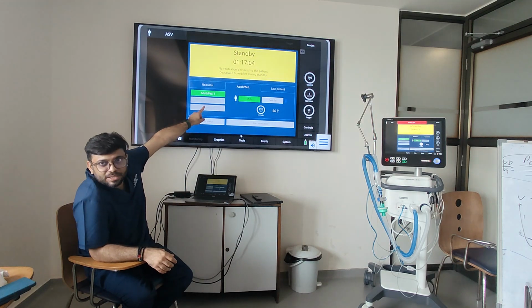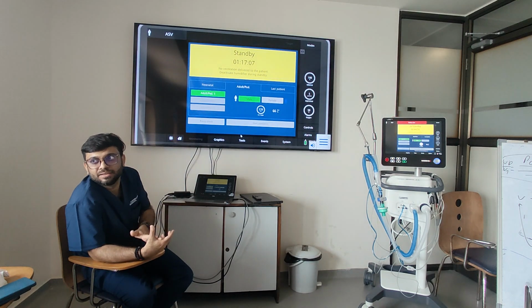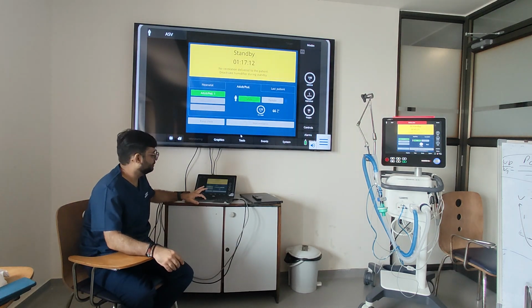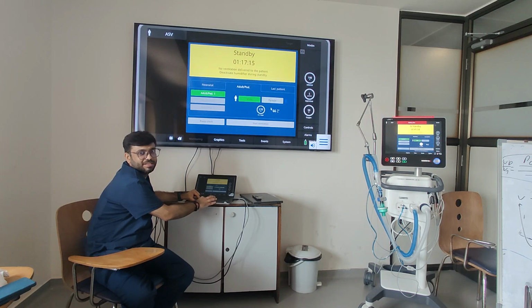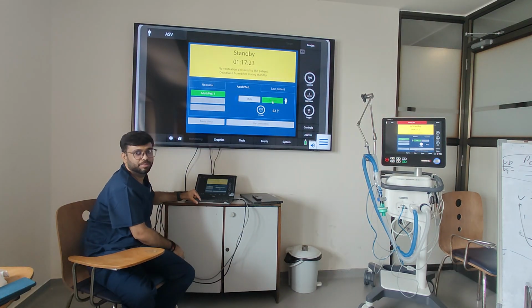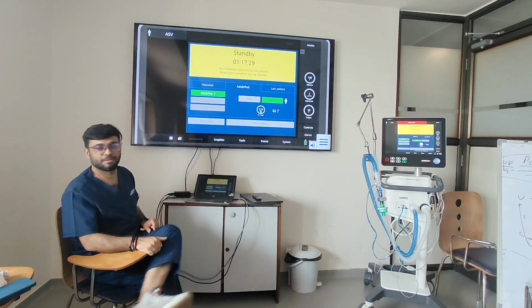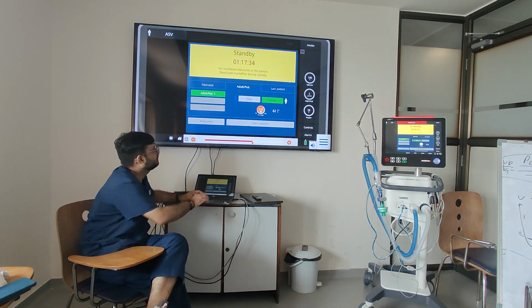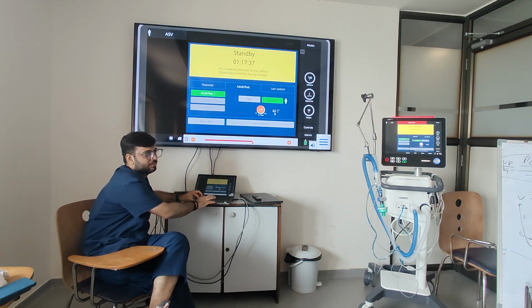Okay. So we first set the patient category. Already set everybody. Then ideal body weight. I said it's a female. It's a female, right? Yeah, it's a female. So we'll select the patient category, we'll change to female. Then I set the height. Say quickly, whatever you see, what to do. According to height, weight, according to weight, tidal volume. You set the height. What you want to set, you tell him on the ventilator. Height, how much you want to set? So his height is 180. 180. Okay.